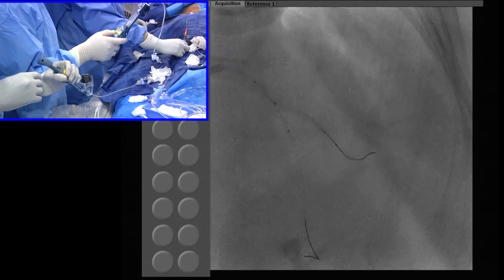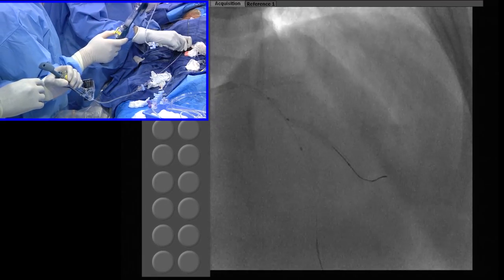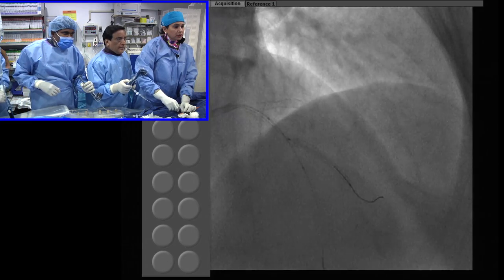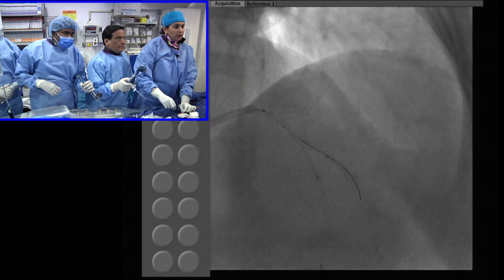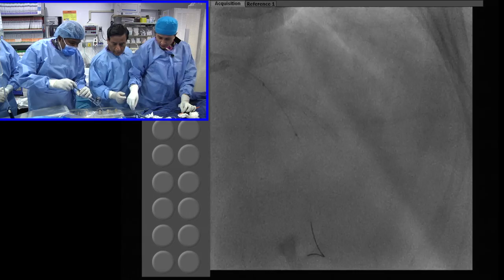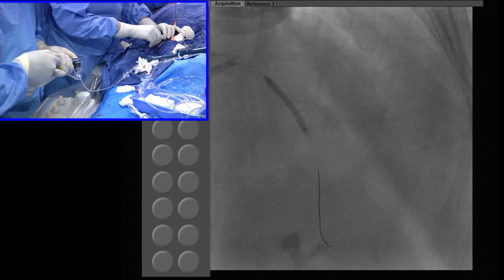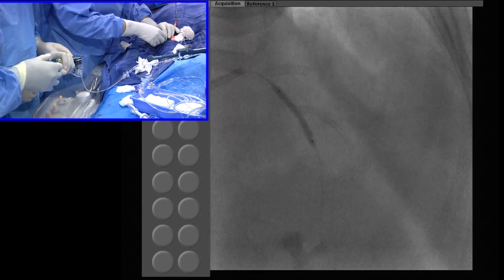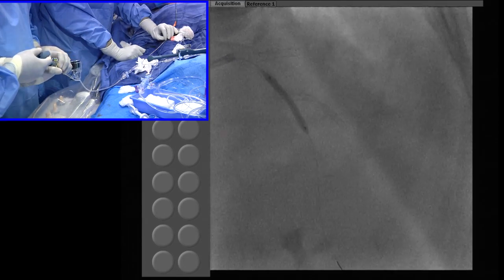Okay. So now we are deployed because remember the diagonal is barely just at the 2.5 vessel size. So now we take out everything. No need to go much higher. It's a Promus stent there? Yes. Okay. Take out the wire also. Crush it. 10, 12, 14. So absolutely no problem getting the stent there, 15, the BVS. Hopefully will not be a problem because right now we are dilated, this crushed a little bit.